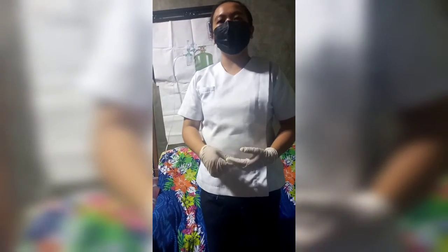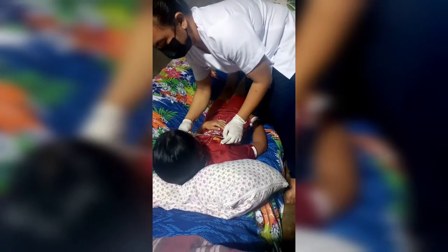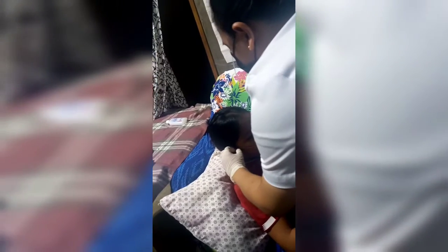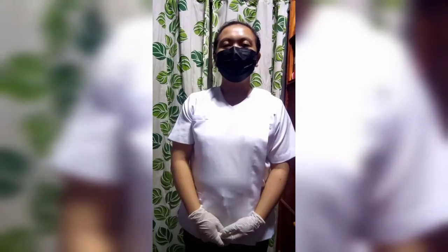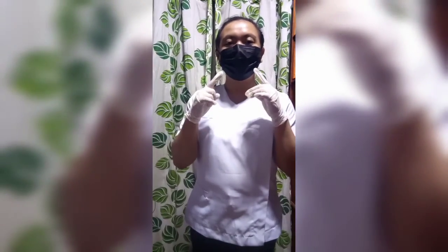Next is to place the prongs in the patient's nostrils. Just relax. Place the prongs in the patient's nostrils.